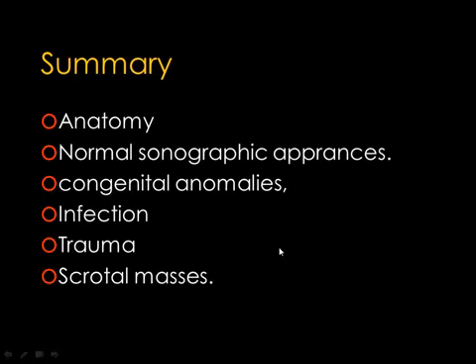Finally, let us summarize what we have discussed. We reviewed the anatomy of the scrotum, its normal and sonographic appearance. We discussed common scrotal pathology, including congenital anomalies, infection, trauma, and scrotal masses. Thank you.